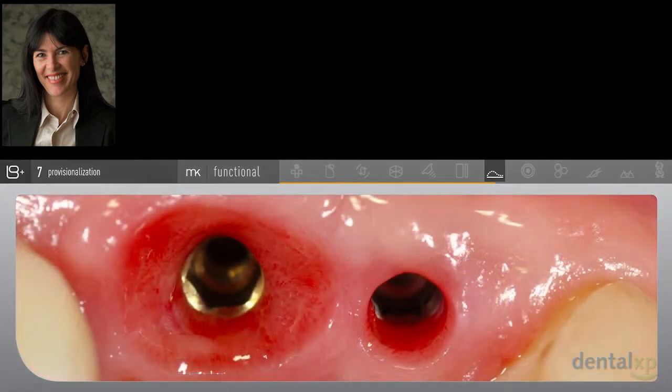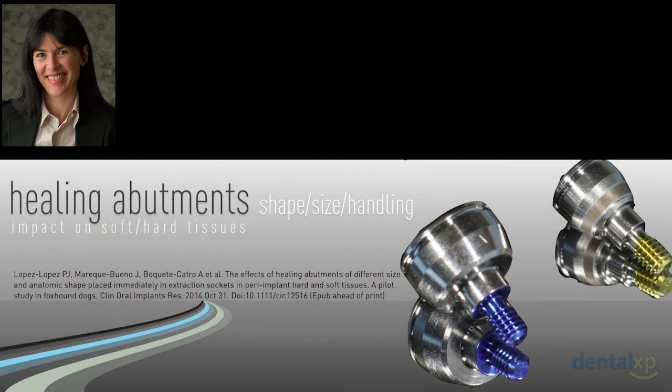This example really nicely contrasts the healing abutment versus the transmucosal temporary restoration. You've got perfection of tissue architecture, so if you have to transfer this information to your technician, you've given a great picture of what your vision is for the subgingival prosthetic envelope. Whereas with a healing abutment, you gave them a little hole, and certainly you hope that you're not going through to definitive restoration at that point in time.